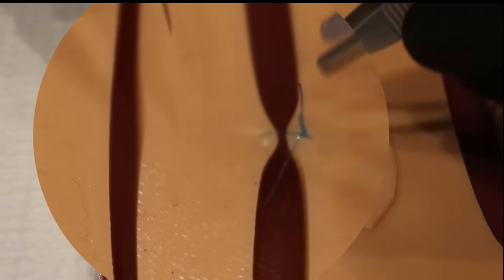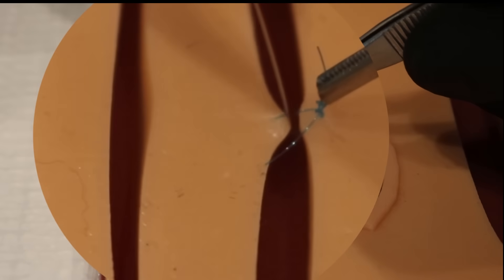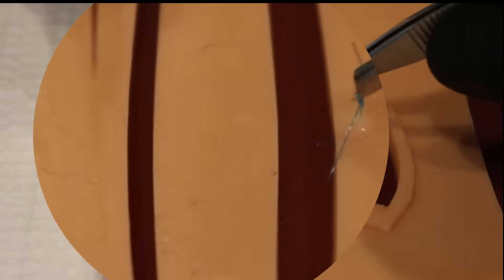Here's a zoomed-in view again. Grab that tail, nick it. And one more time, slow it down. There you go, grab it, and like butter.